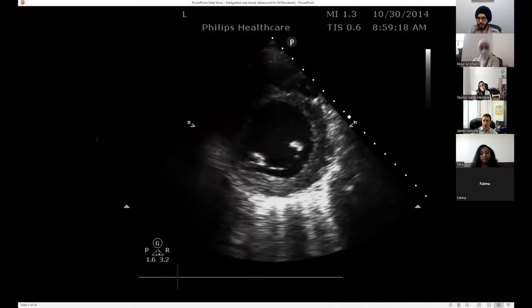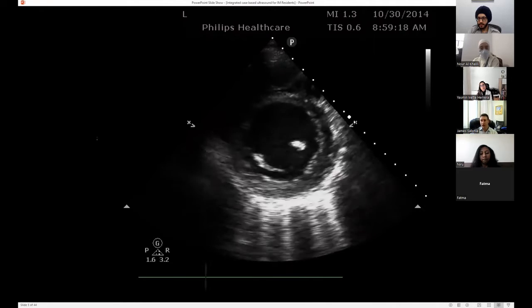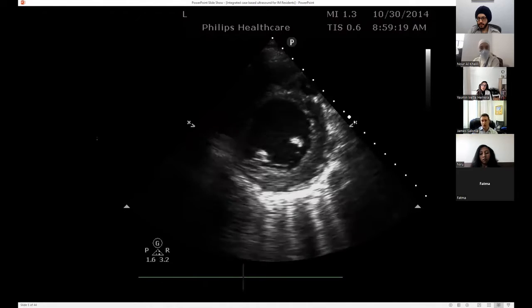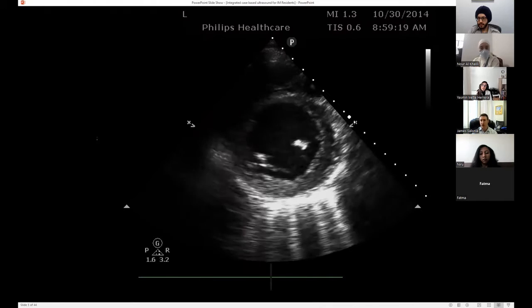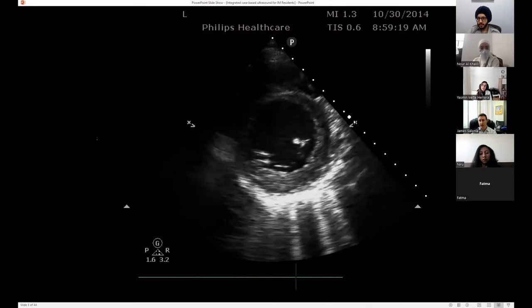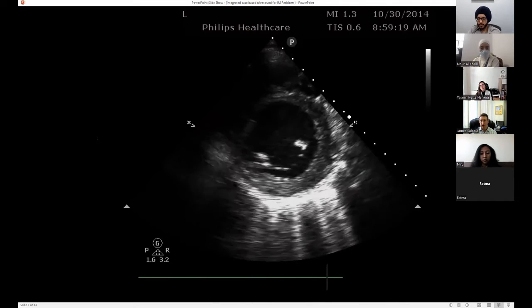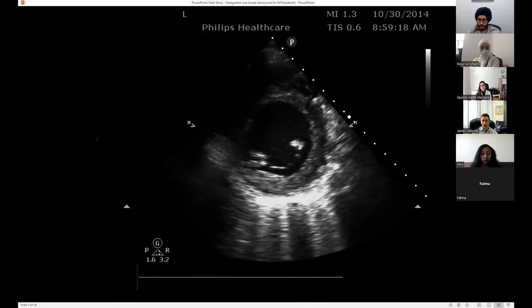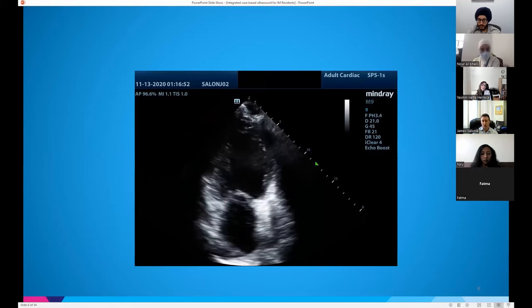Again, for the point of POCUS, for us in critical care, we really want to know if somebody is hyperdynamic, if they're normal, if they're depressed, or they're severely depressed. Whether or not their EF is 30 or 35% really does not have a big clinical implication for us, right? For long-term, for cardiologists, they want to know which direction the EF is going. That's important. But for us right here in the acute setting, it's, are they hyperdynamic, are they normal, or are they depressed? And that's what we're trying to really gauge here. So now we turn this view, and what view is this?